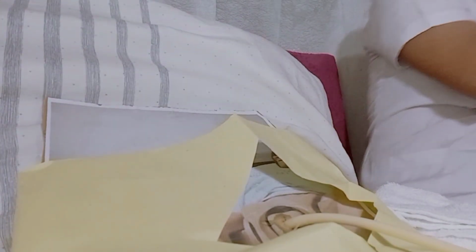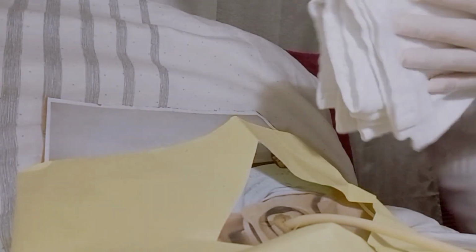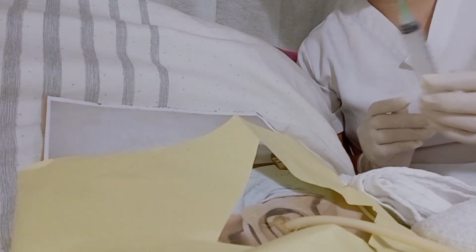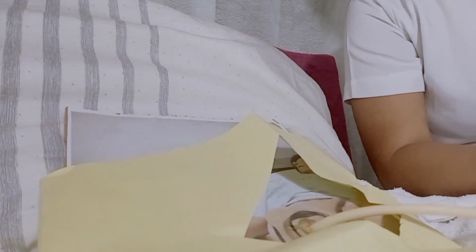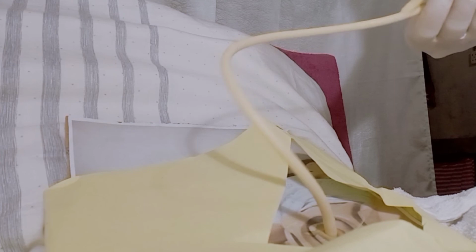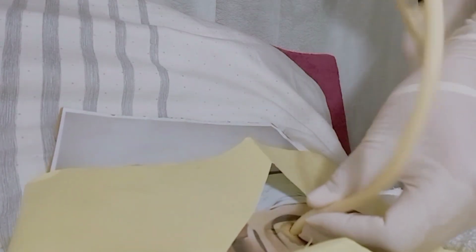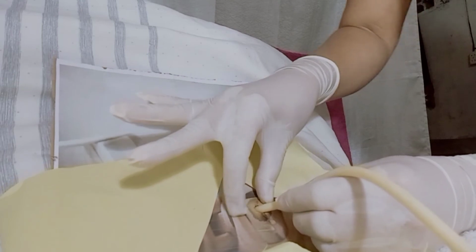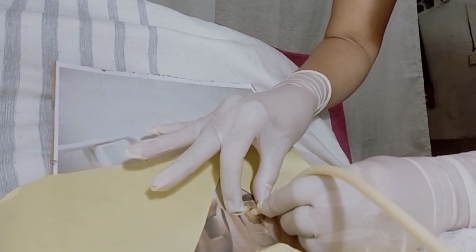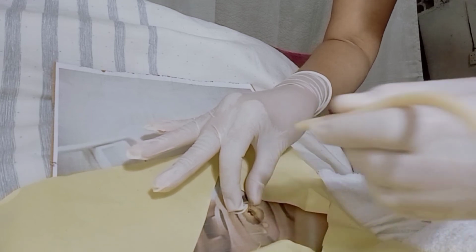All you're going to need is two sterile cloths and a syringe to pull back the air of the balloon, so you can release the tube in the urethra. Pull back the air to release the catheter. Use your dominant and non-dominant hands to open the labia majora and minora and carefully remove the catheter.